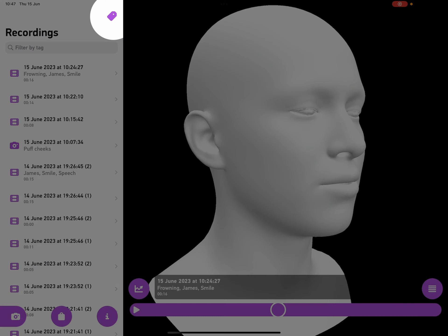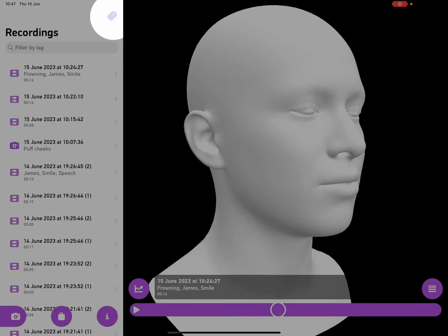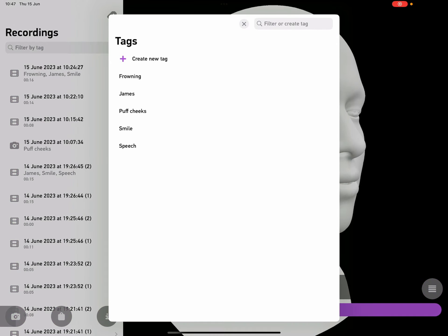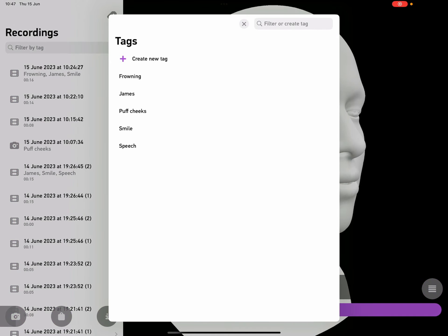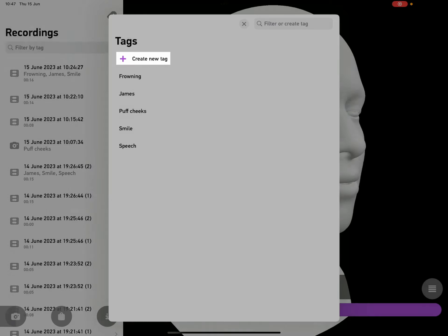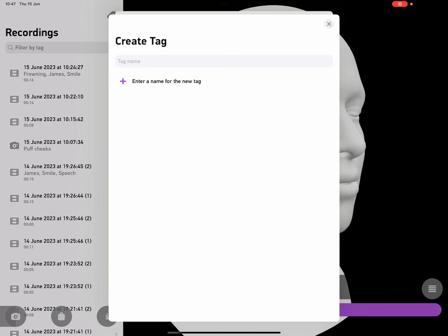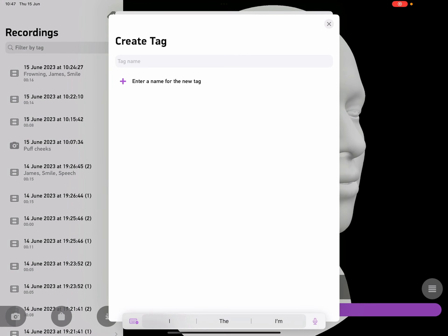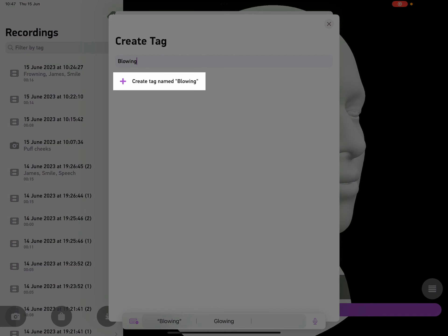Then I can tap on the tag button in the top right of the recording screen, and it shows me all the tags in the app. So I can tap on create new tag to create a brand new one. Maybe I'll call this one blowing. Then tap the button to create the new tag.